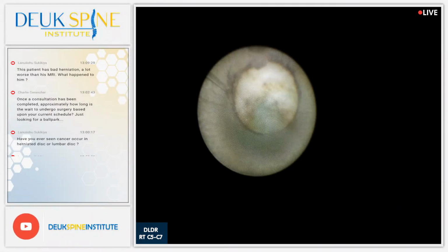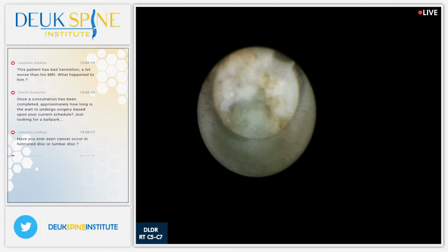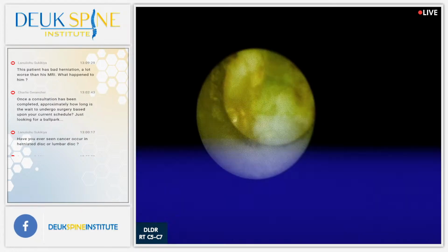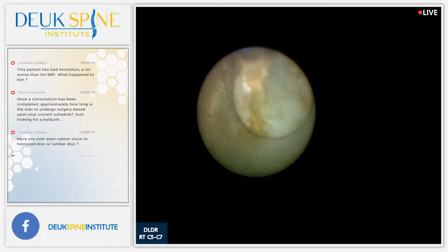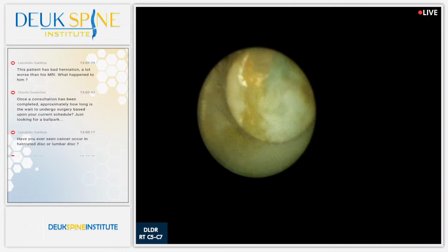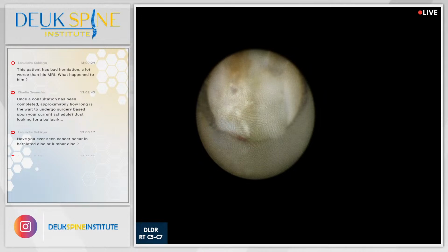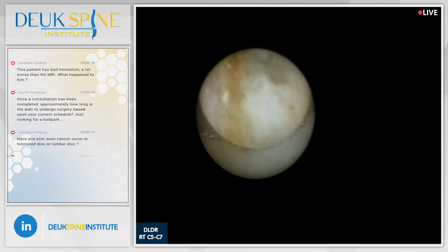All right. Well, I said we're almost done, and I think now we finally are almost done. All this material that was here was pushing on the nerve root, sitting in the foramen here, just underneath that blue coloration. And we've removed probably 60–70% of that material so far.